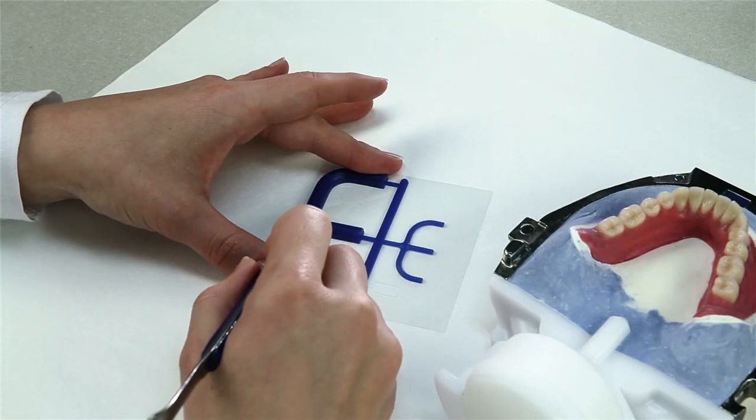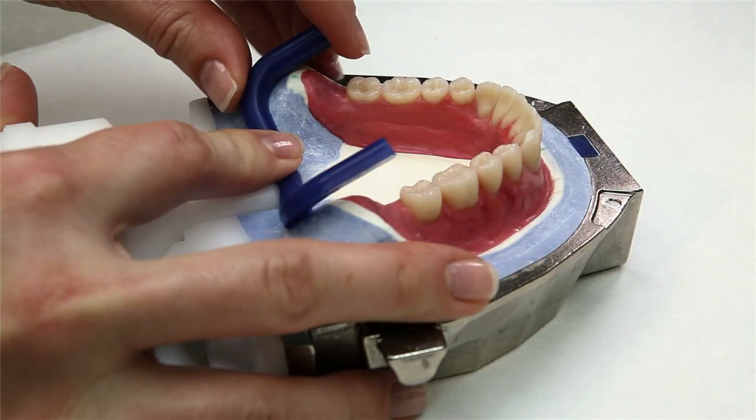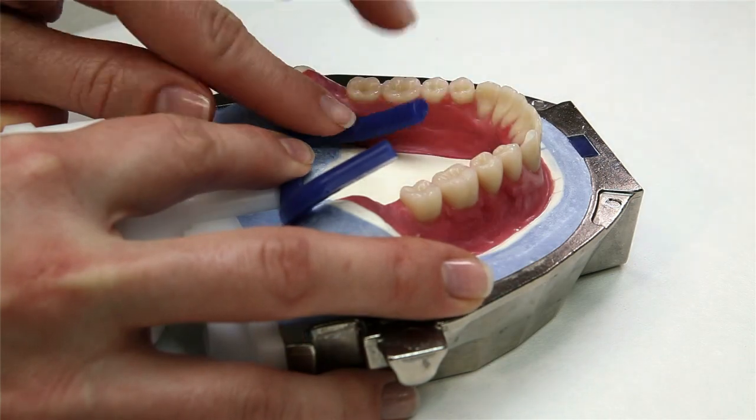For mandibular complete dentures, cut off the center sprue and place the outer sprues in the lingual area of the retromolar triangle.